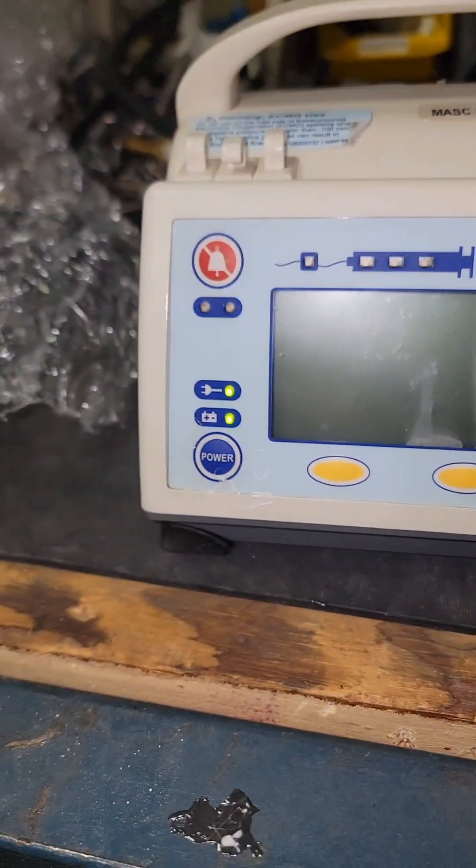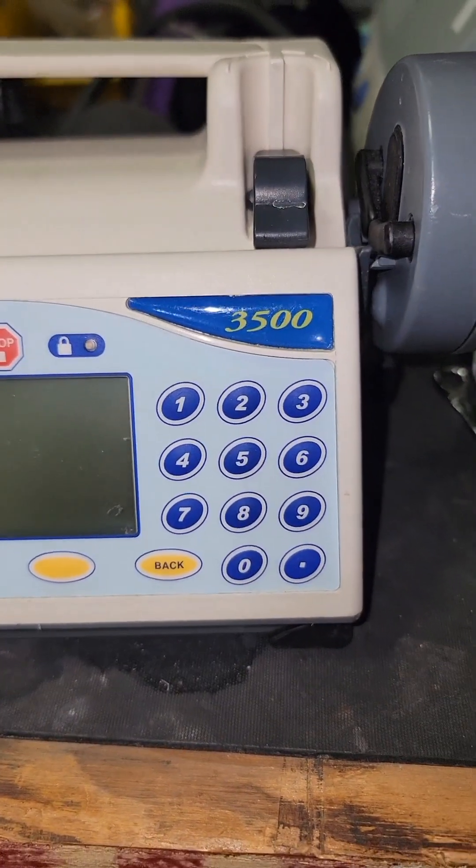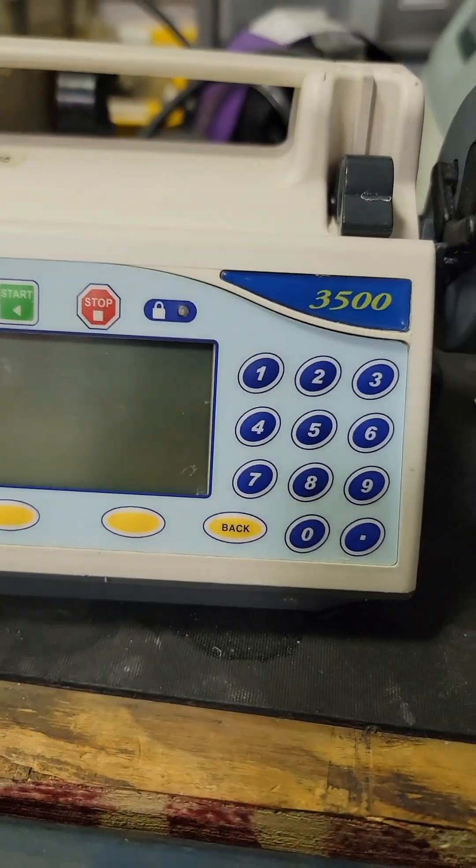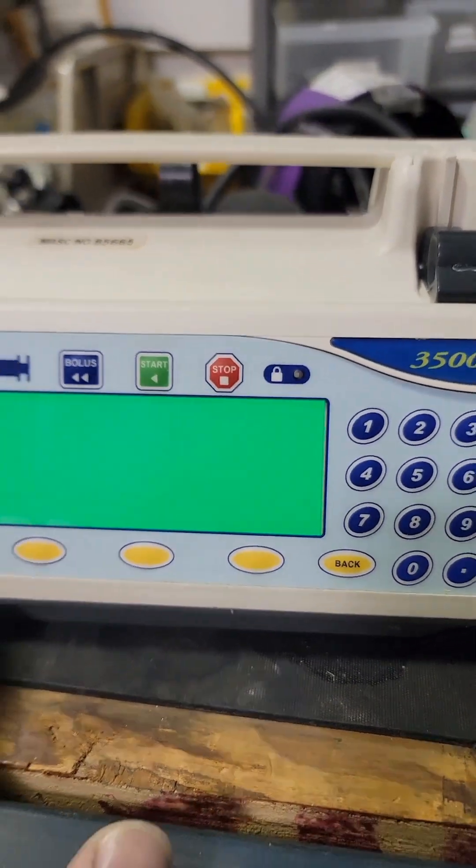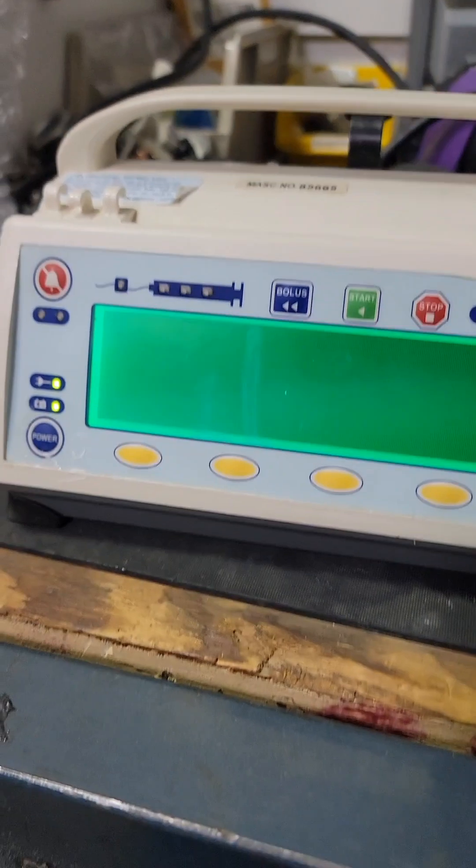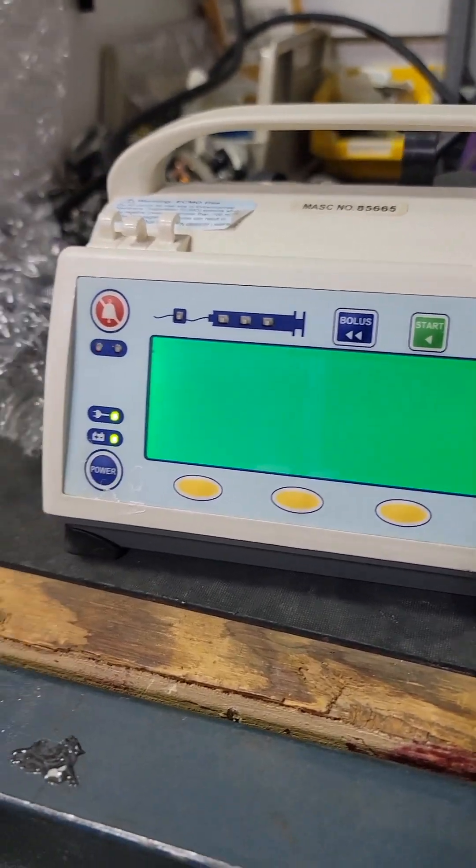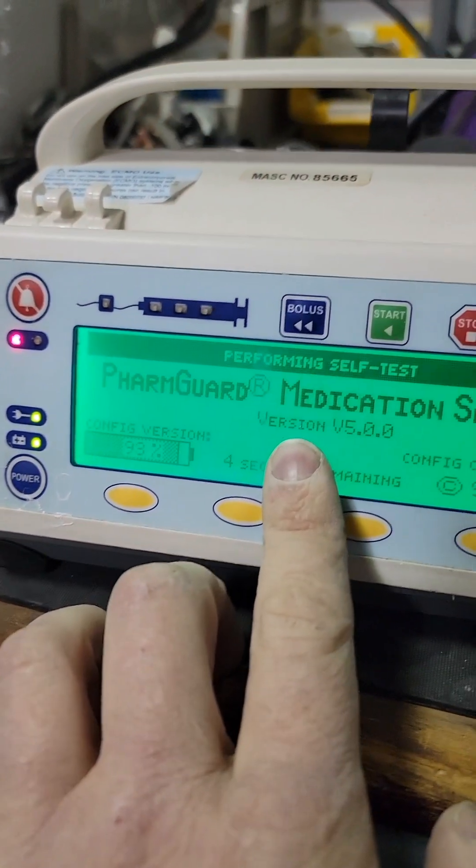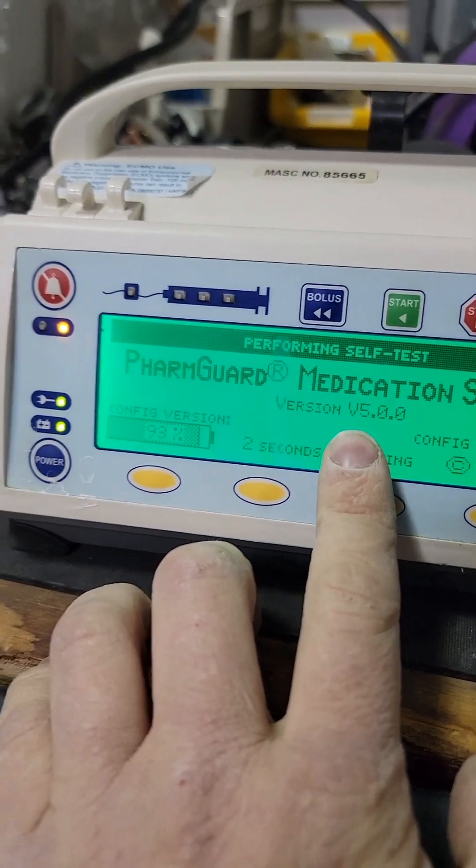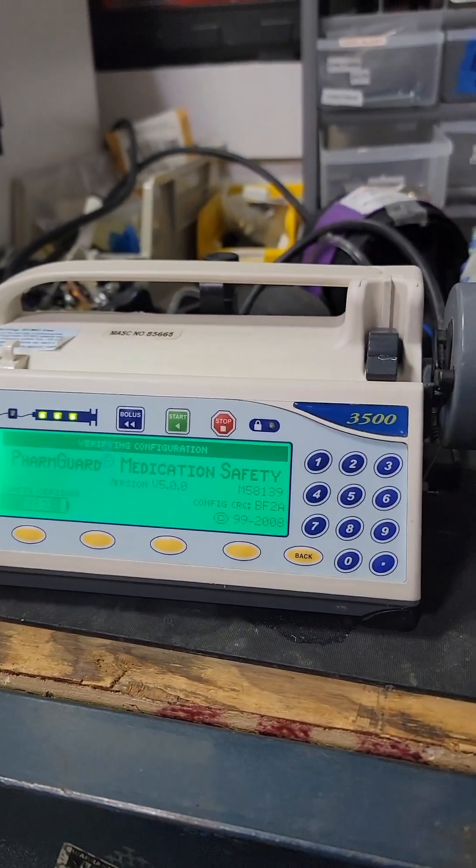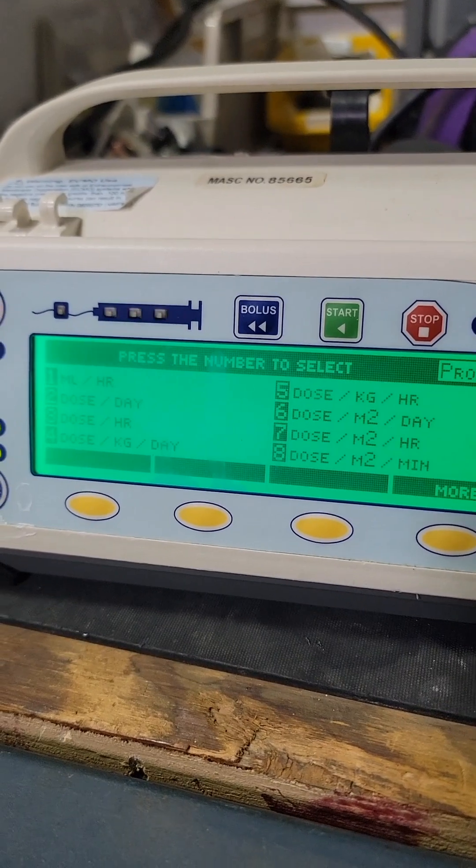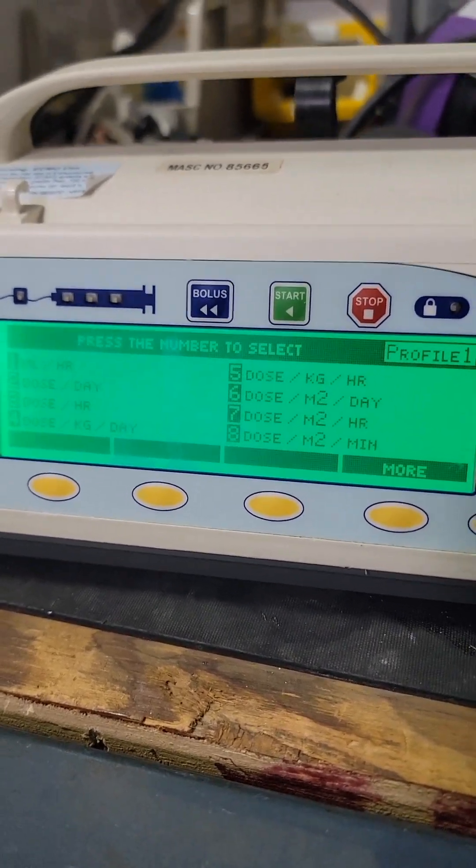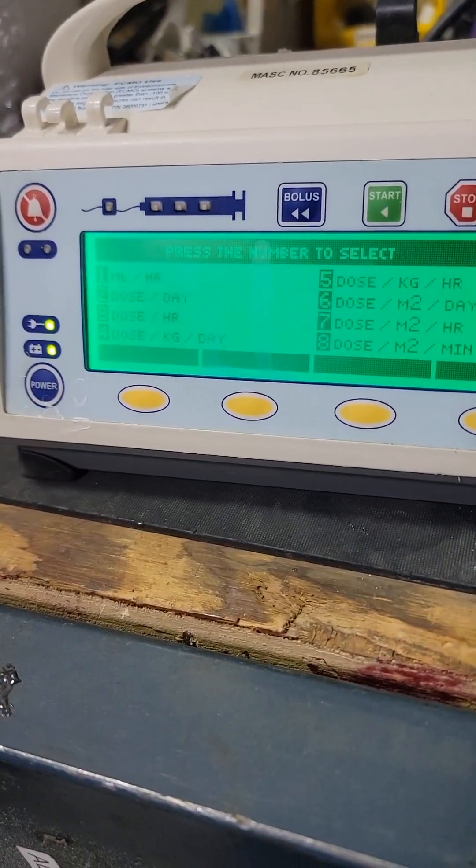Calibration of the Medfusion 3500 from Smith's Medical. It's important right here your version information, this is the latest software and what you need in order to do the software upgrade for the recall if you have the PharmGuard software.